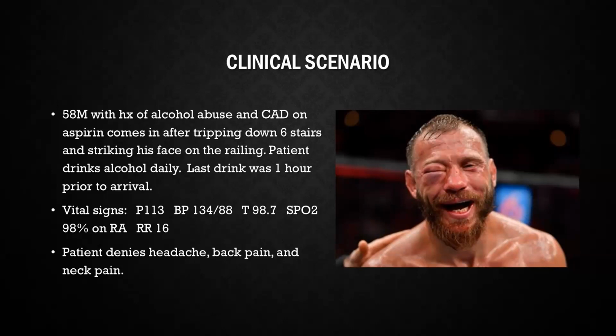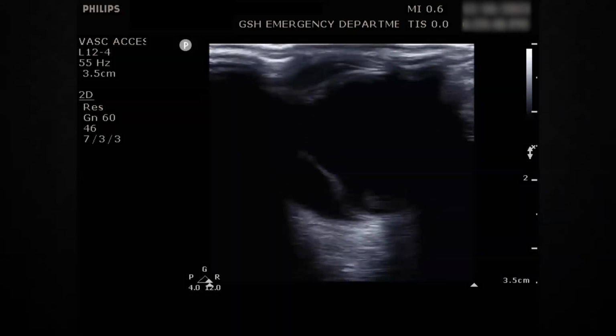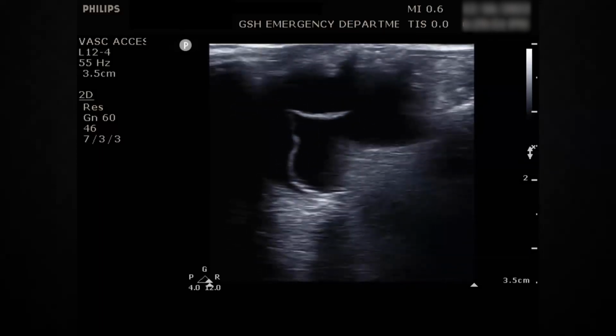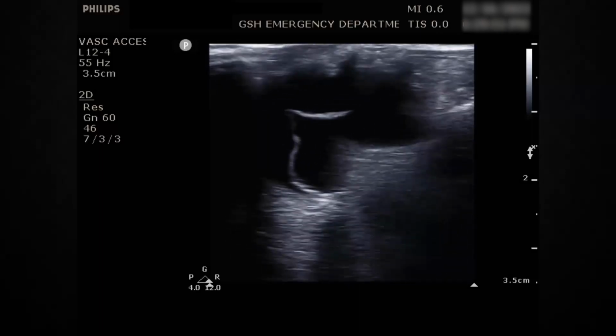So you put an ultrasound on, and you're obviously looking for many different things, but you find this. You see a membrane in the back of the eye. And as you remember, there's a few different detachments we can see. So how are we going to differentiate this? Let's look at the video. It's a little bit mobile. The membrane's a little bit on the thin side. And as you scan through, it looks like it's tethered down to the optic disc. And so this is a retinal detachment.